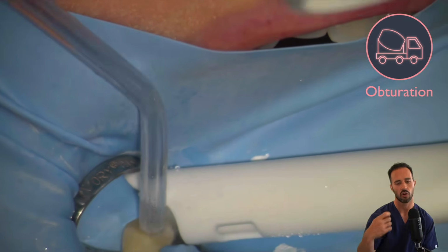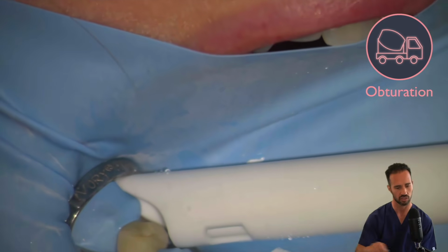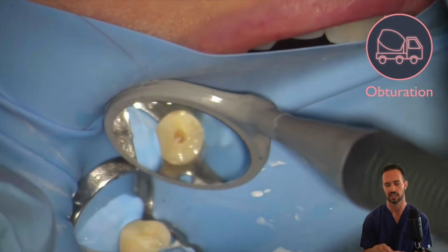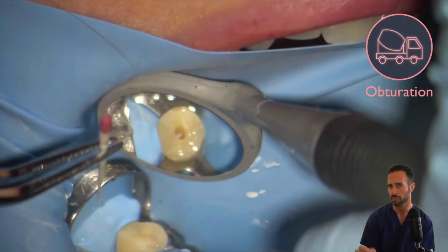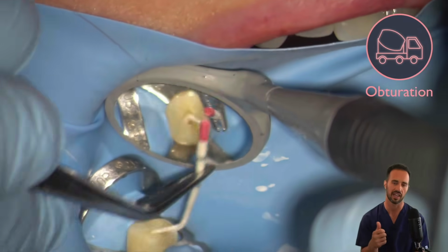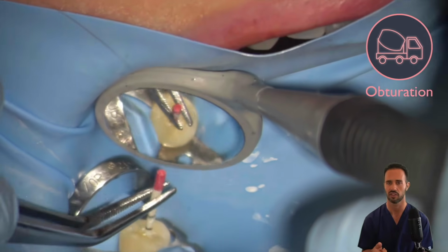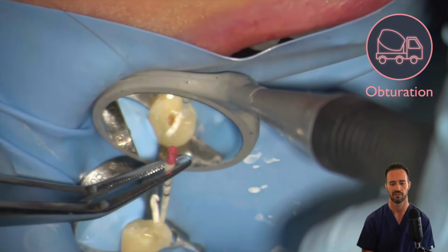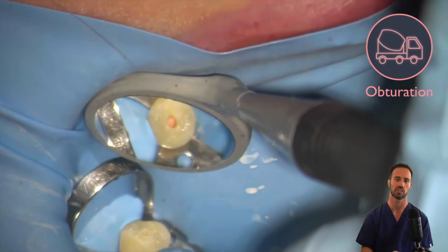But then we're going to rinse off all our excess sealer with your air water syringe. You're just going to spray a lot of water in there. That's going to do the trick. And you might find that you need to kind of play with the internal aspect with a paper point, and maybe with the pluggers again, just to make sure you don't have any excess sealer internally, and to make sure that there's no flakes of gutta percha or anything like that. You want to have a nice clean area that's going to set you up for the next phase, which is the restoration.